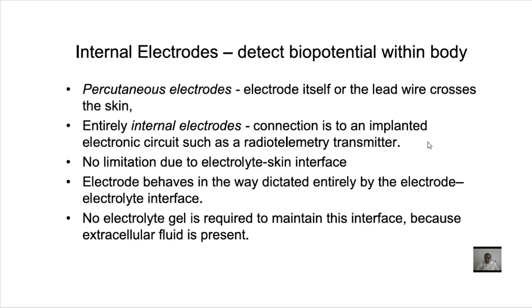No electrolyte gel is required to maintain this interface because extracellular fluid is present here. So as it is inserted into the skin, no gel is needed. The resistance problem of the skin need not be considered here. So that's why there is no gel needed here.